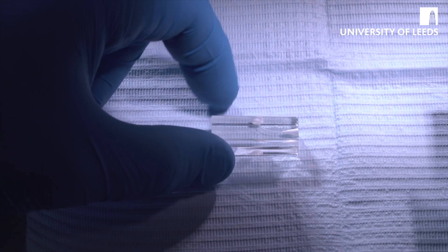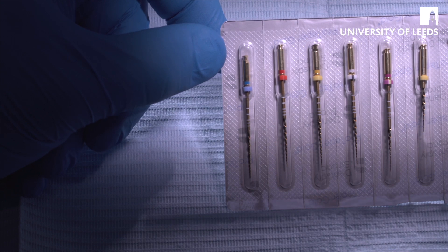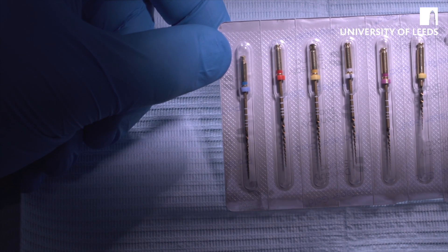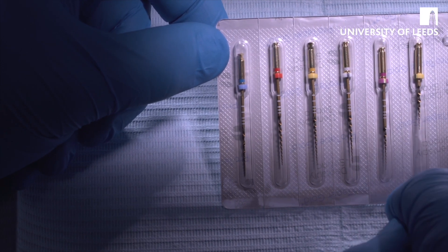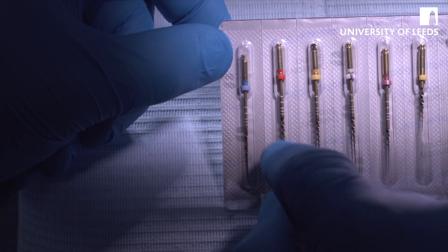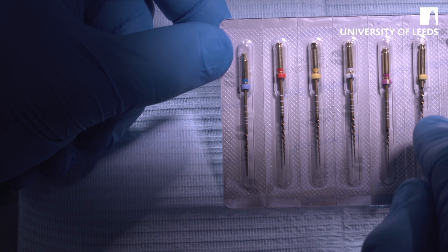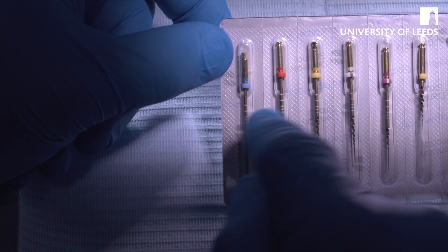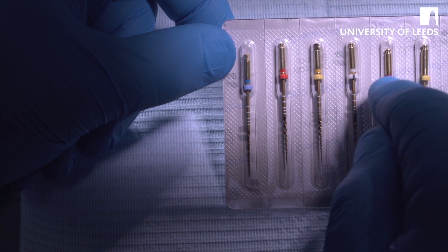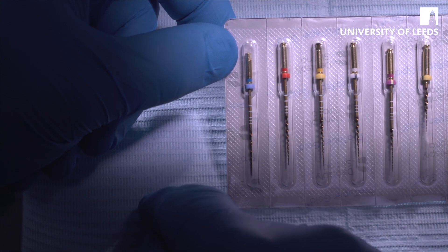The system itself comes in individually blister-packed packs. You've got the Shaper X file, the Shaper 1 file, the Shaper 2 file, the Finishing 1 file, the Finishing 2 file, and the Finishing 3 file. The files are used in order from right to left, so starting with SX, to S1, to S2, to F1, to F2. It's rare that you'll be using the F3.